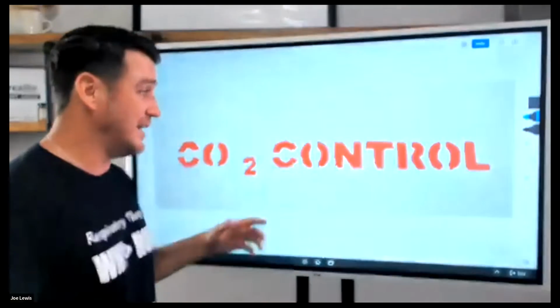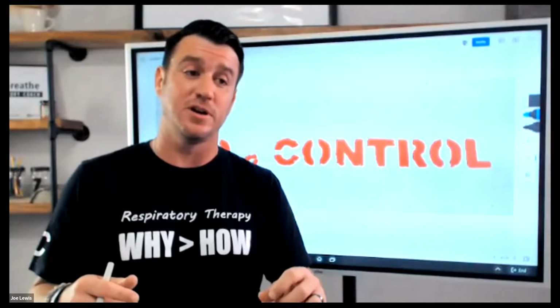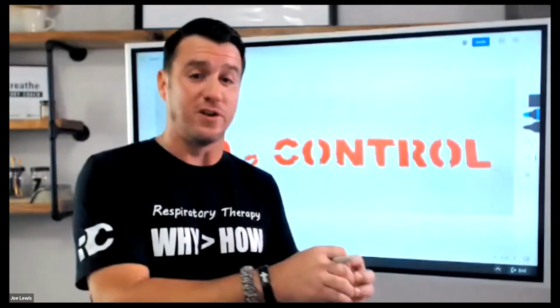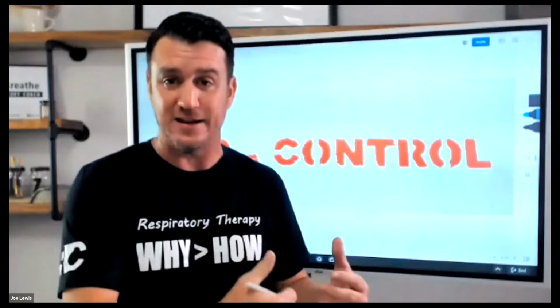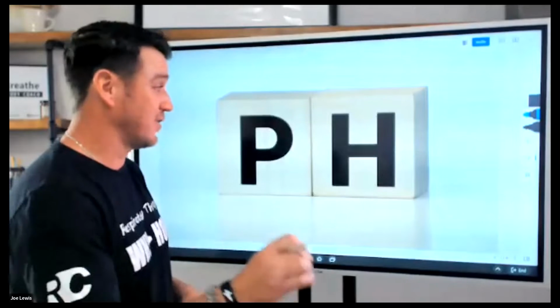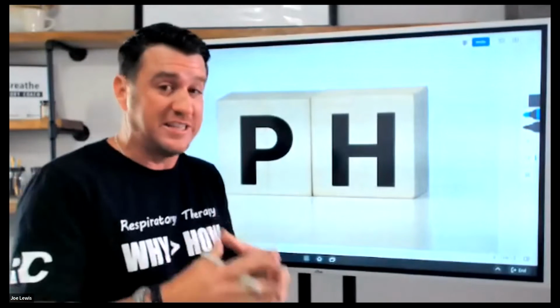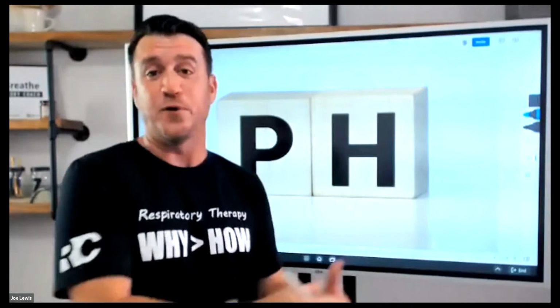Both of those things can happen during mechanical ventilation. And so we recognize that when we adequately assess carbon dioxide levels and the appropriate removal of it, then we eliminate those hazards, right? Now, here's the kicker though. The kicker is that we can't just look at CO2. You can't just get a blood gas and go, oh, this person's CO2 is 40, we're ventilating perfectly.